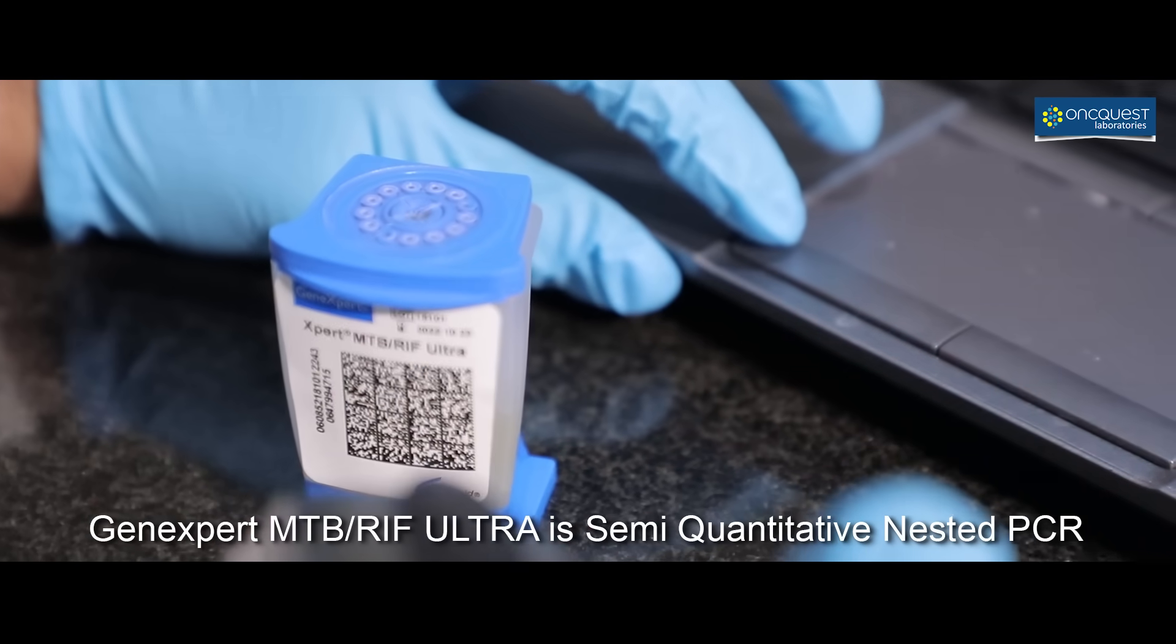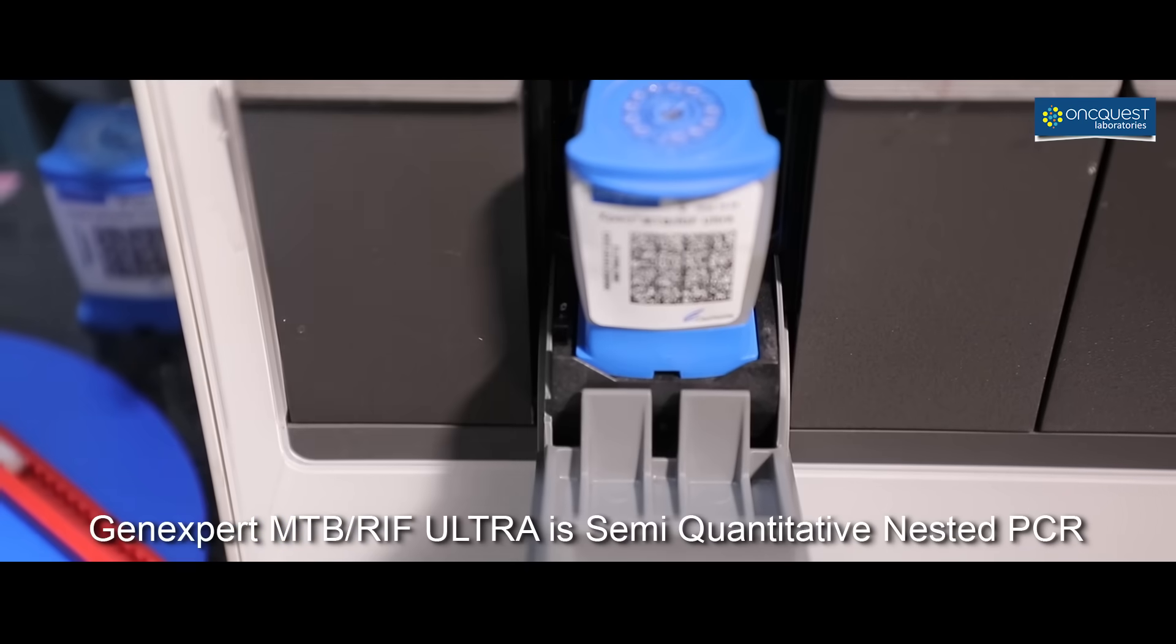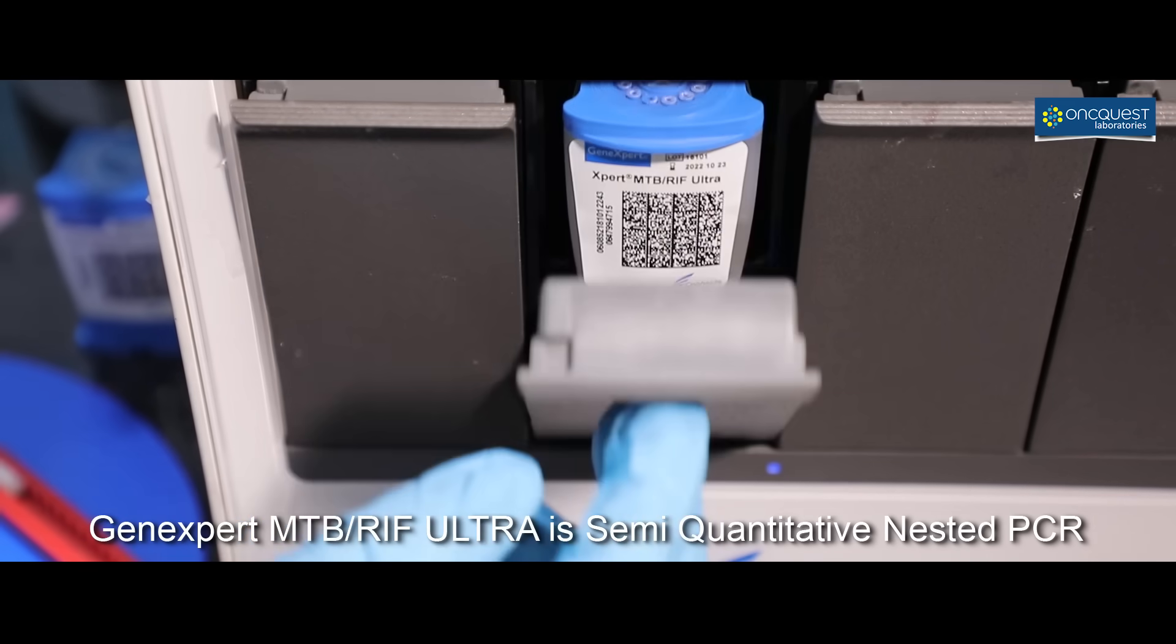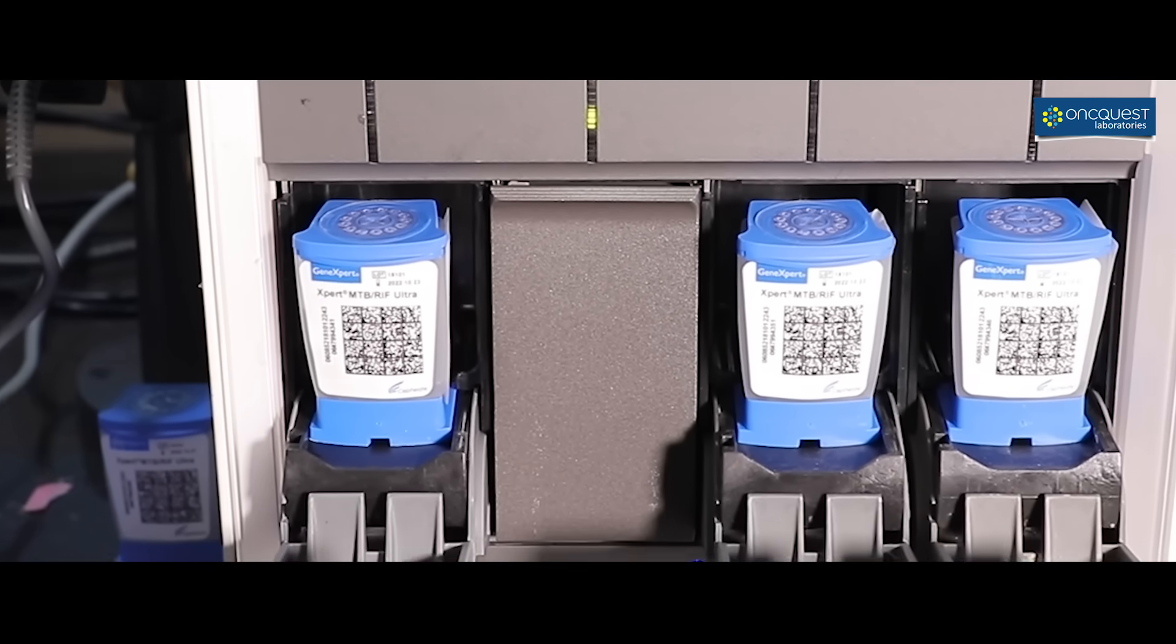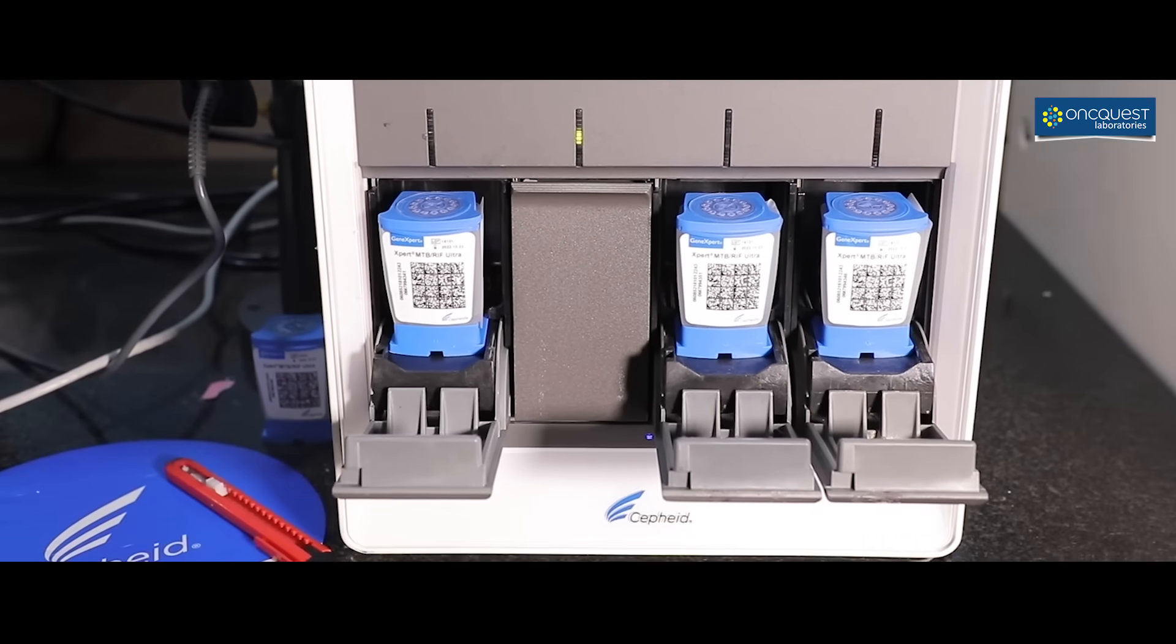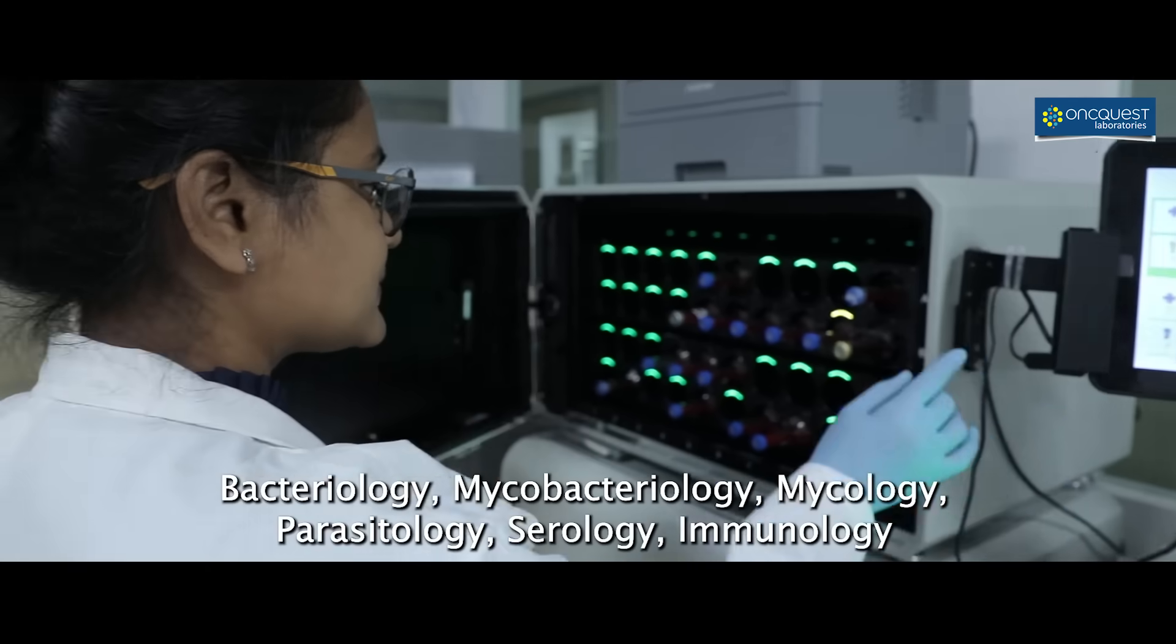GeneXpert MTB/RIF Ultra is semi-quantitative nested PCR with high resolution melt technology resulting in better discrimination of rpoB mutations with a turnaround time of less than 80 minutes. It has 5% higher sensitivity than GeneXpert MTB/RIF, which impacts smear negative culture positive patients and also improves detection of mixed infections.